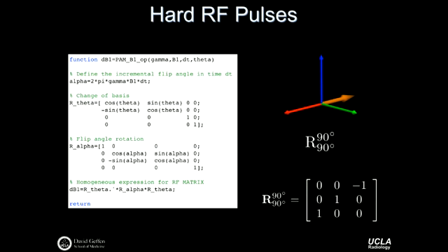So let's say my phase was 270. Where does my thumb point? Minus y, right? 0, 90, 180, 270, right? So let's say it's 270 for my phase and 90 degrees for my flip angle. Where does my bulk magnetization land? Plus x. So we got a few more plus x's out of that answer than we did with the first plus y.